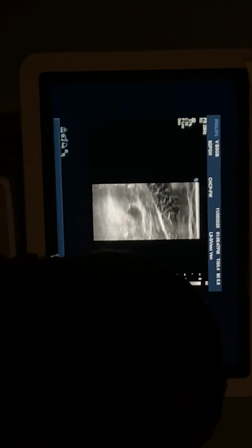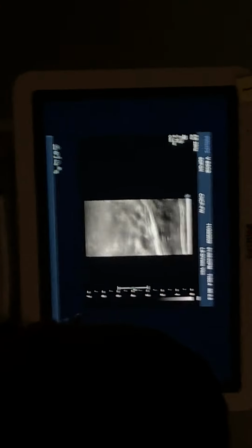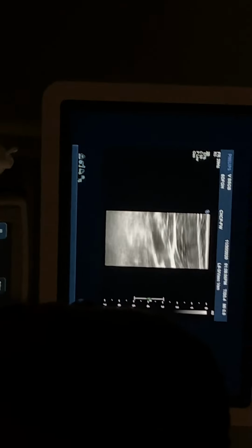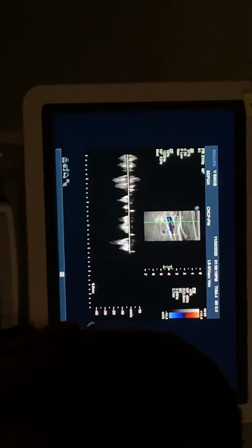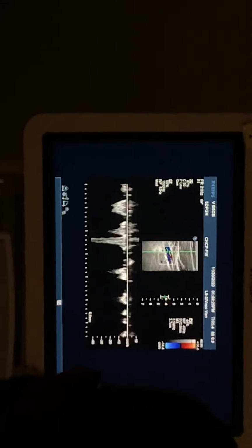So we're going to come distal. Distal to the branch of the cephalic is the axillary. So we're going to take that without and with compression. Color and Doppler. Now does it ask for an augmentation at the axillary? Yes. We're going to go mid-arm and squeeze. So we have our augmentation.